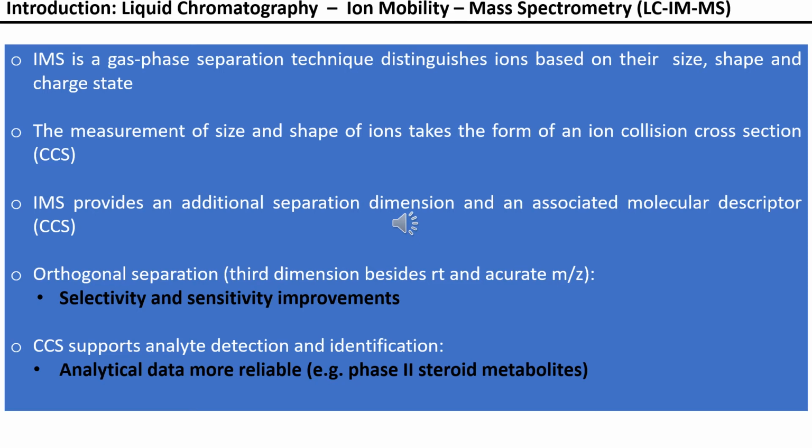Ion mobility combined with LC-HRMS can exclude stereoisomers interference, which is not fully resolved by LC-HRMS techniques alone. And CCS is an intrinsic molecular descriptor of gas phase surface area. Then it can be used also as an identification point for steroid target analysis. Thus, this parameter can increase the reliability of some identification process usually faced in doping analysis.